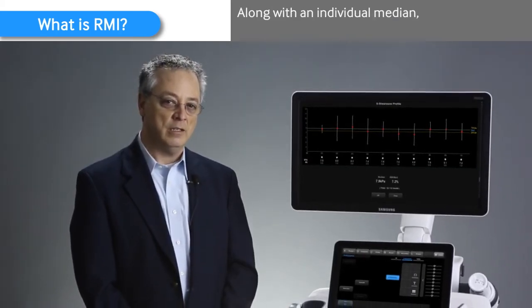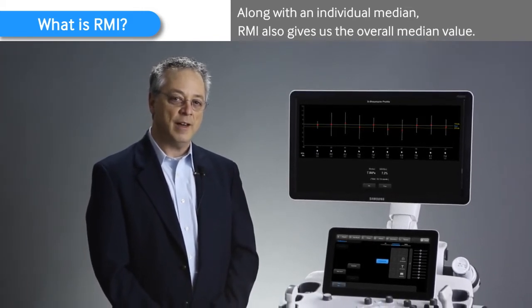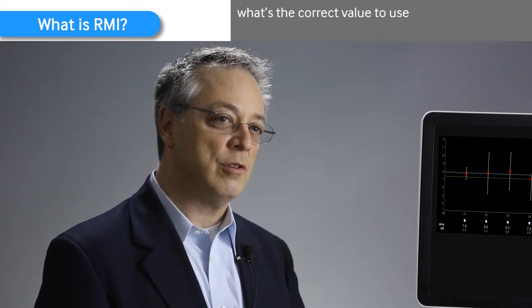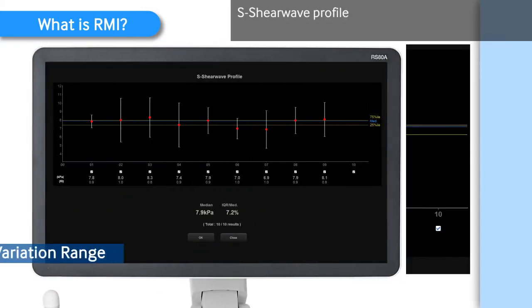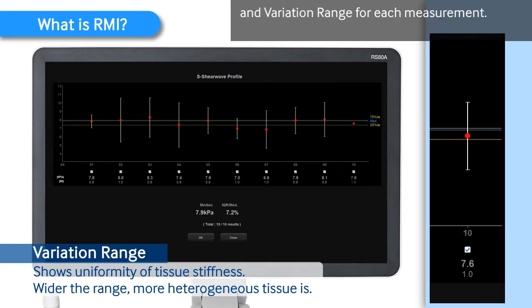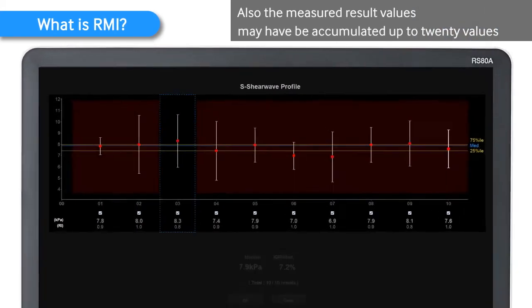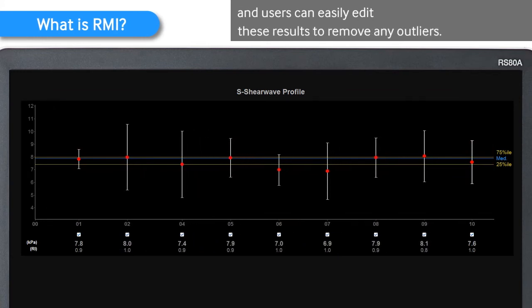Along with the individual median and RI, it also gives us our overall median value. With this graph, we're able to determine what's the correct value to use for our overall determination of disease. S-ShearWave Profile provides a reliability index and variation range for each measurement. The measured result values may be accumulated up to 20 values, and users can easily edit these results to remove any outliers.